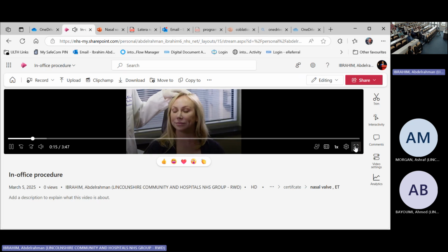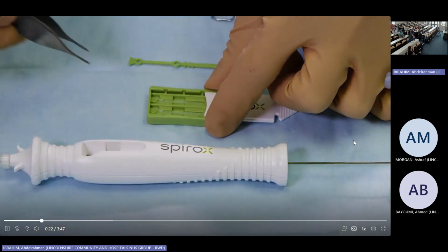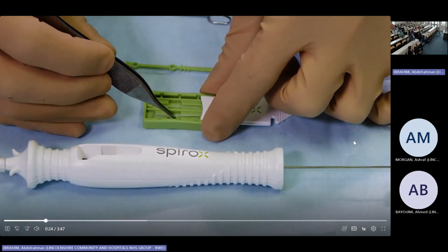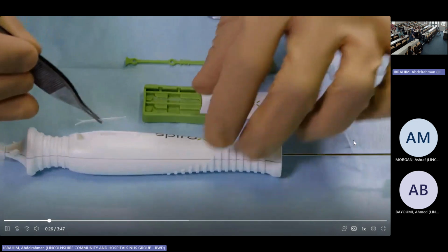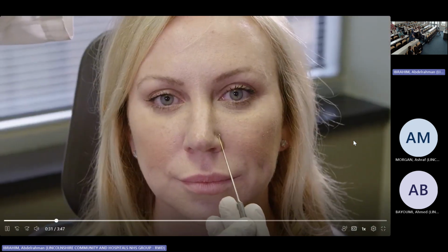And she has significant problems breathing through her nose. What I would like to do today is talk to you about the use of Latera, which is a product from Spirox, which can be placed in the lateral wall of the nose to aid in lateral wall support. When she breathes in, she has difficulty breathing through both nostrils.